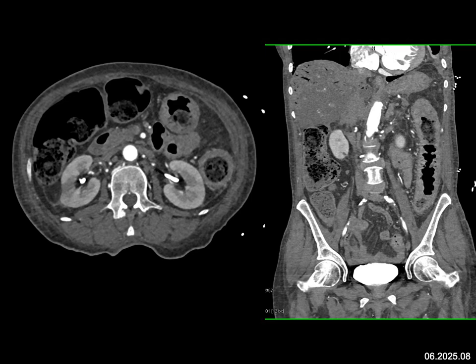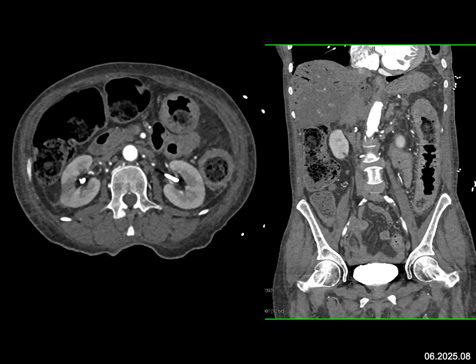We don't have all the vessels. There's plaque in the aorta, but I don't see occlusion of the IMA, the SMA, or celiac — though we don't have those images. This was ischemic colitis.